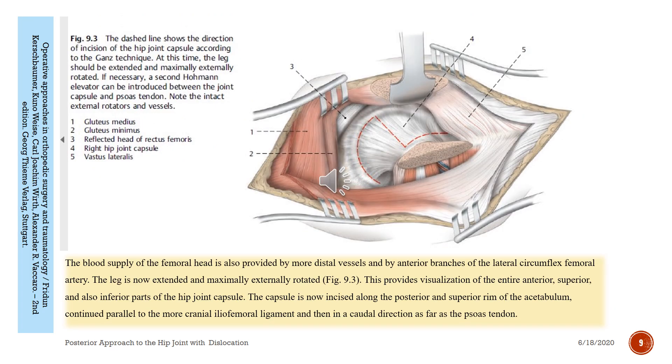The blood supply of the femoral head is also provided by more distal vessels and by anterior branches of the lateral circumflex femoral artery. The leg is now extended and maximally externally rotated. This provides visualization of the entire superior and inferior parts of the joint capsule. The capsule is now incised along the posterior and superior rim of the acetabulum.